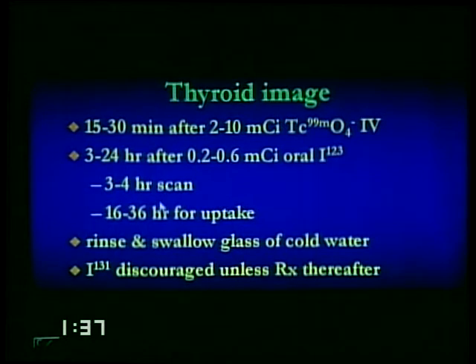Early uptakes are done on the same day, later on in the afternoon, and delayed uptakes are done the following day. So at least a period of 16 hours should elapse. Typically, you have to know what your range of normal uptake is for the geographical area that you live in, because there's variation depending on your water supply.